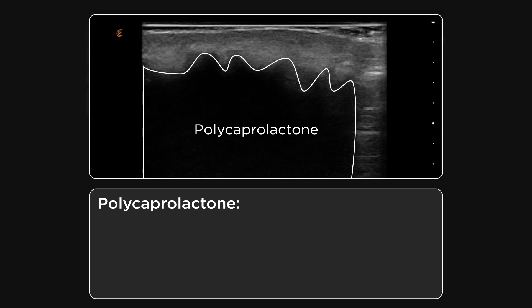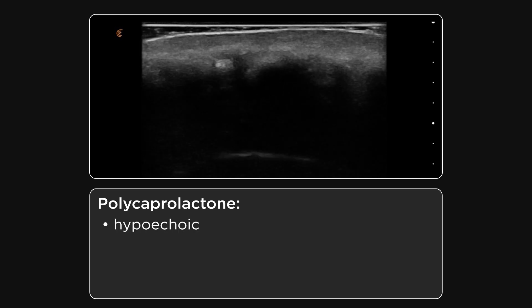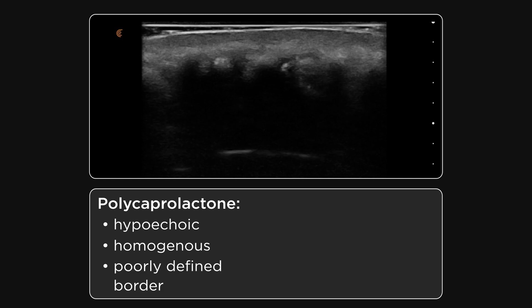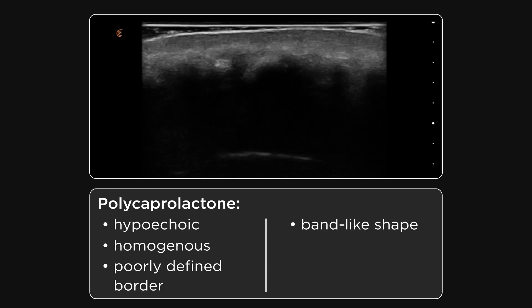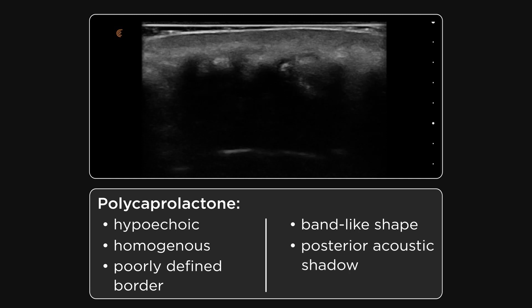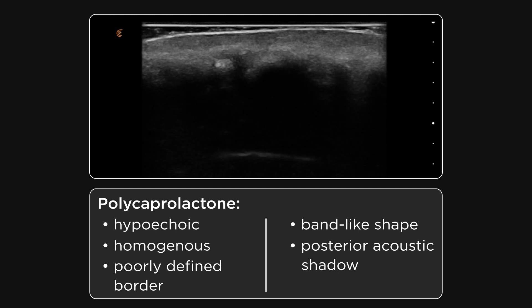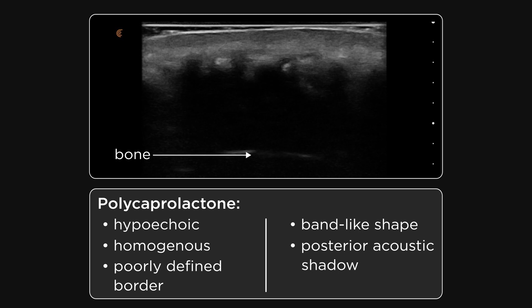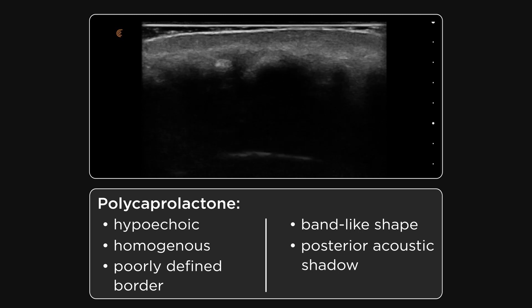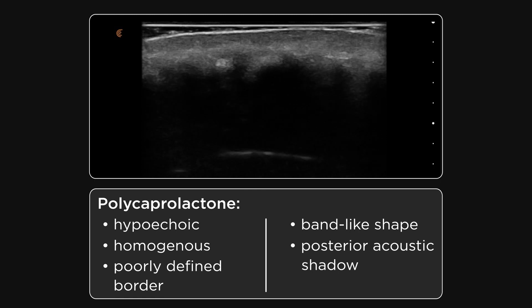This is polycaprolactone, often marketed under the trade name Elance. This is a synthetic hydrophobic filler that is hypoechoic on ultrasound. It appears homogeneous, has a poorly defined border and band-like shape. PCL creates a significant posterior acoustic shadow blocking out the tissues beneath it. This image is of the jawline and the tissues including bone beneath the filler product have been completely shadowed. Elance is a very popular collagen-stimulating, long-duration product in South America and in Europe. You will likely see this in your patient population.